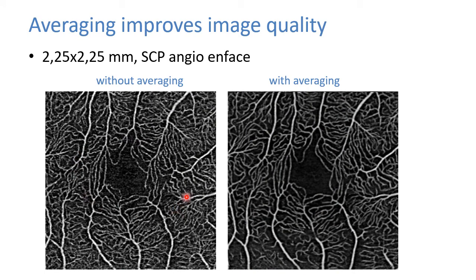While images obtained by the beam expander technology are already amazing, the first thing we did was to see if averaging them could even further improve the images. And as you can see here, averaging indeed increases the linearity of vessels, increases the contrast and makes the image more informative. So we are going to use this averaged image here for comparison to traditional technology.